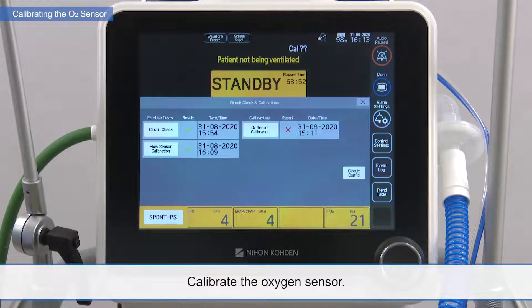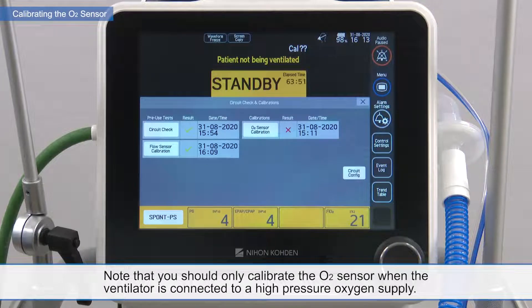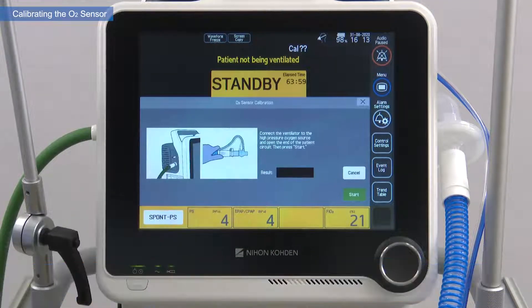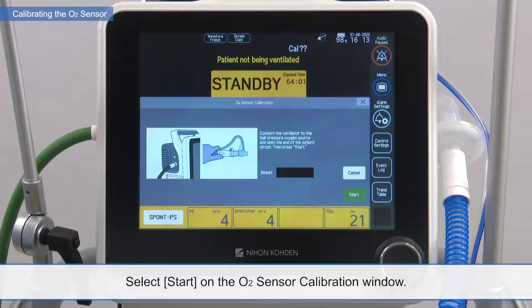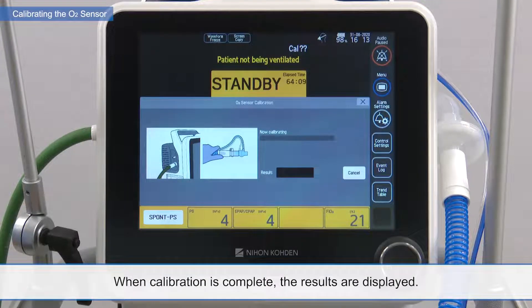Calibrate the oxygen sensor. Note that you should only calibrate the O2 sensor when the ventilator is connected to a high-pressure oxygen supply. Select O2 sensor calibration on the circuit check and calibrations window. Select Start on the O2 sensor calibration window. When calibration is complete, the results are displayed.